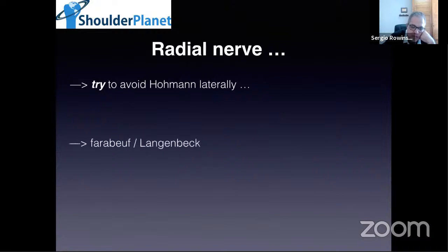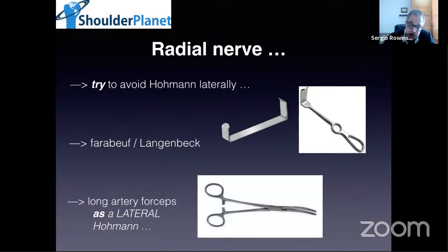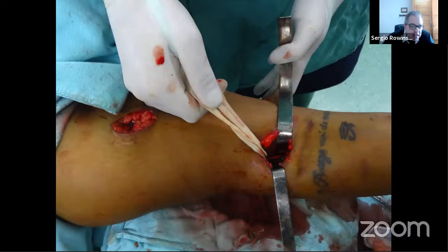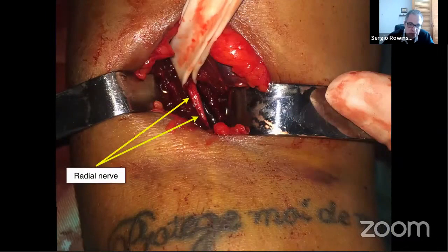I start with these instruments: a Farabeuf retractor on the distal lateral triceps, and the coracobrachialis medially. One tip that I developed is to use a long artery forceps as a lateral Hohmann, but many times I put a lateral Hohmann and I never have problems with the radial nerve, to be very honest. I used to tag the radial nerve in the very beginning, but I gave up for many reasons. This is a very old photo from the beginning, but I haven't tagged it for more than 8 years.